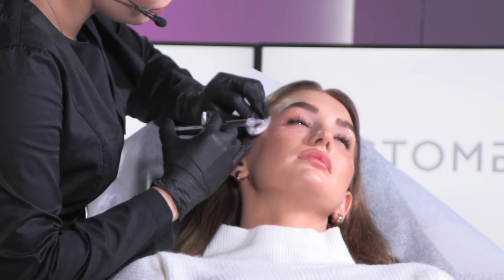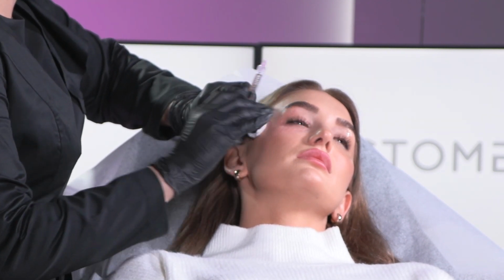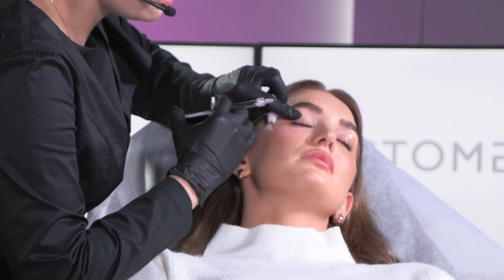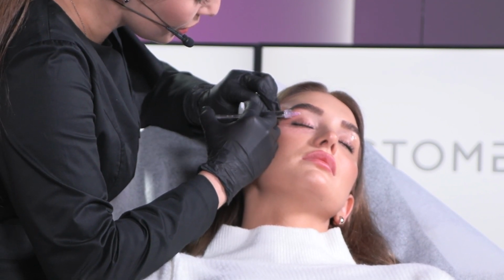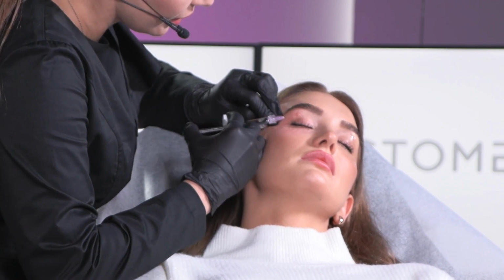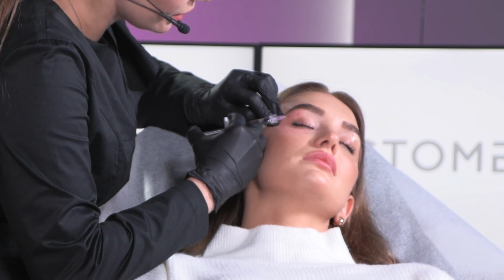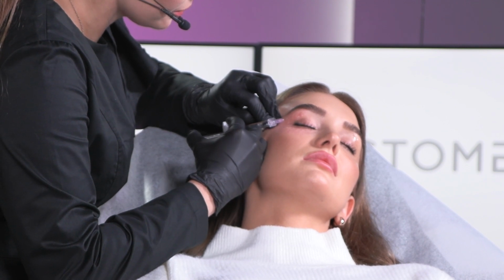It can be 2 or 3 rows on the lower eyelid. Can be even more if you see that you have enough product. Now you can close your eyes if you want, and I go on the upper eyelid, but don't go to the moving parts, just on the top. Also, some of my patients after blepharoplasty like this treatment, because they see a lifting effect, and it helps to improve skin quality, especially around the scars, and make them less visible.